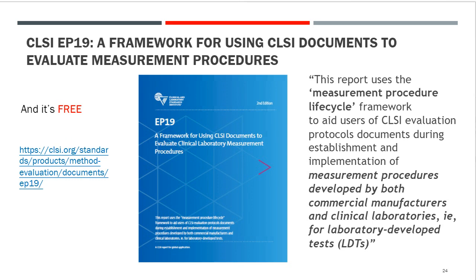I want to go into CLSI EP19 here for a moment. EP19 is a framework for using CLSI documents to evaluate measurement procedures. Technically, it's a report. It uses the measurement procedure life cycle as a framework to aid users in understanding evaluation protocols, particularly CLSI protocols, during established implementation. Measurement procedures developed by both commercial manufacturers and clinical laboratories, including for laboratory-developed tests, LDTs.